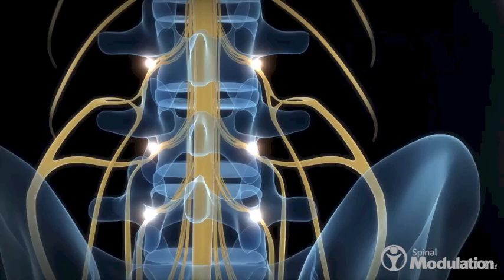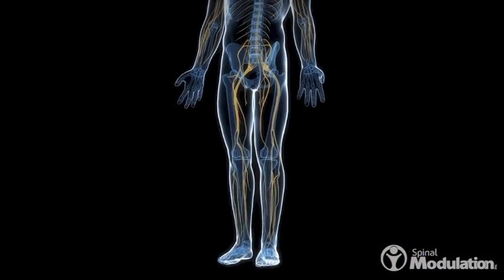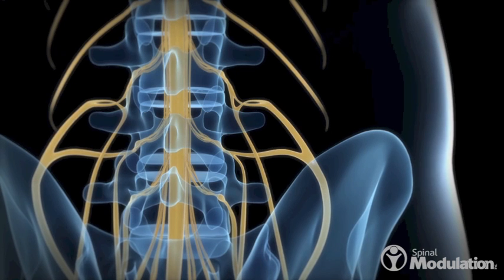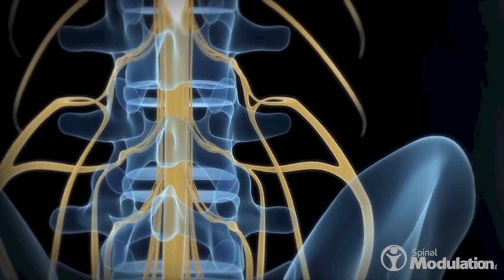The ganglia are organized around spinal nerves that map to sensory dermatomes. This feature allows therapy to be targeted to specific pain areas in the body. At the same time, overlapping innervation patterns also enable broad coverage.